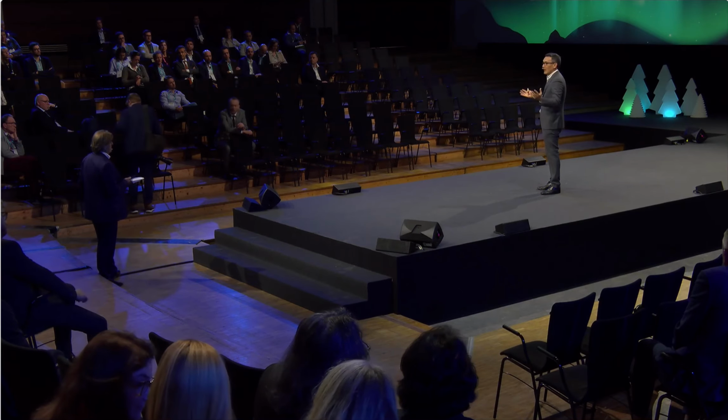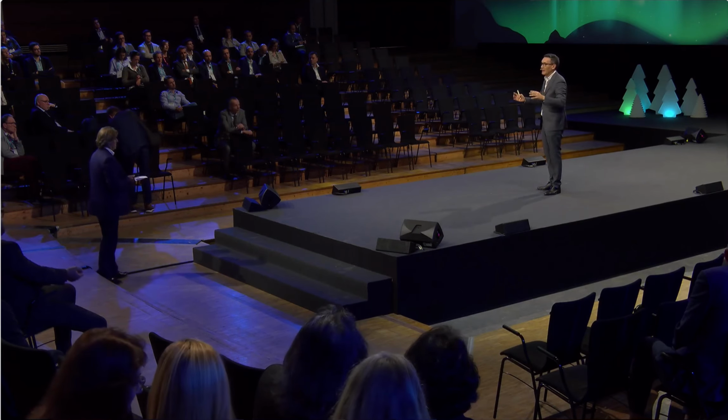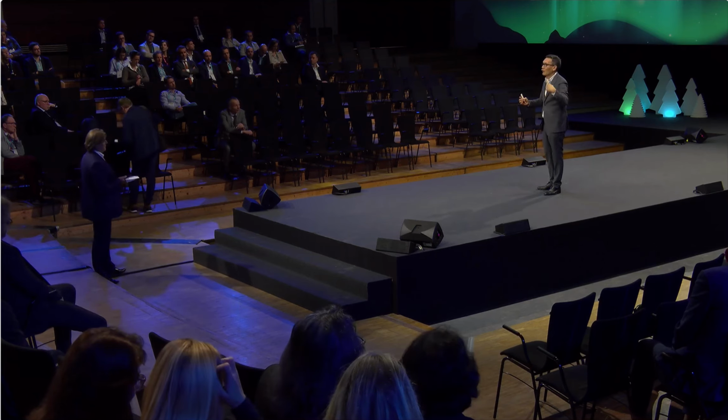So this is a good investment rather than just to balloon and then retreat. Remember, if you just perform POBA, 70% restenosis in 3 months. So if you need to retreat the patient, this is more expensive than to invest in a proper treatment.